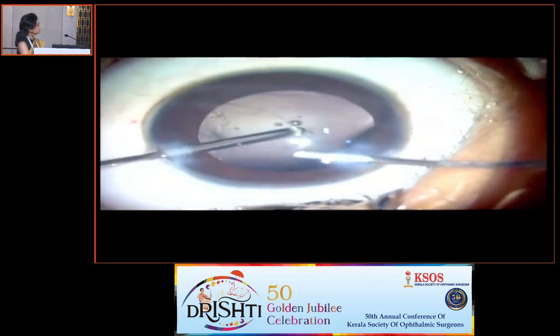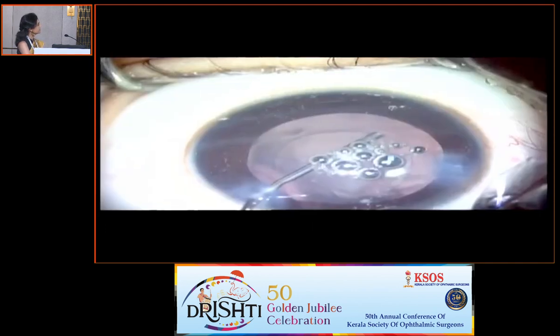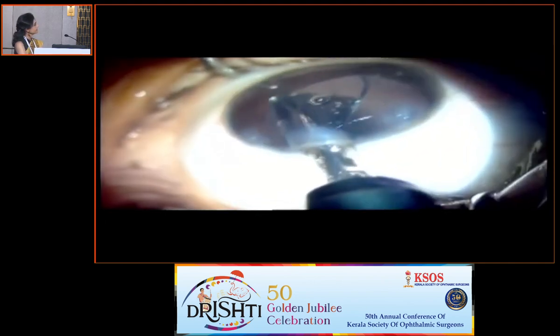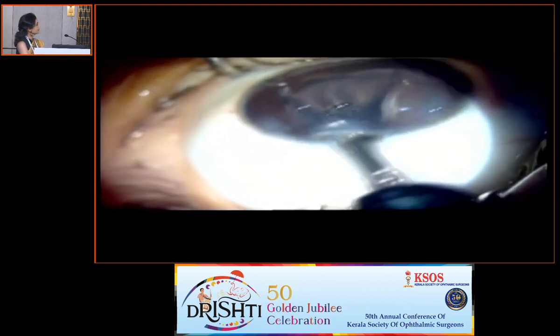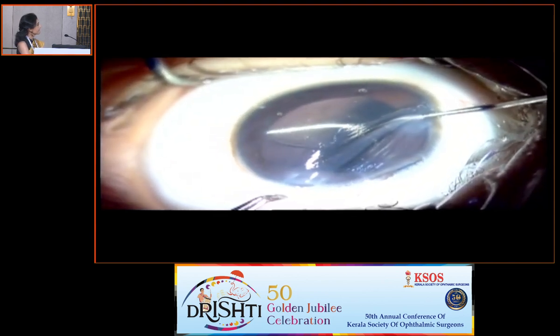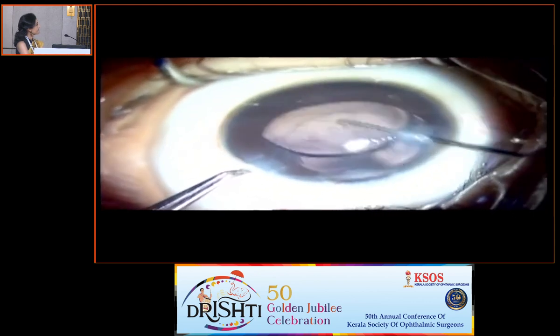So the posterior capsulotomy and anterior vitrectomy is completed, and triamcinolone acetonide is injected to ensure that there is no vitreous in the anterior chamber. The bag is good, but because the posterior capsular defect is large, again we are instilling a 3-piece intraocular lens, this time dialing it into the sulcus and again capturing the optic in the anterior capsular rhexis margin so that the IOL is centered well.